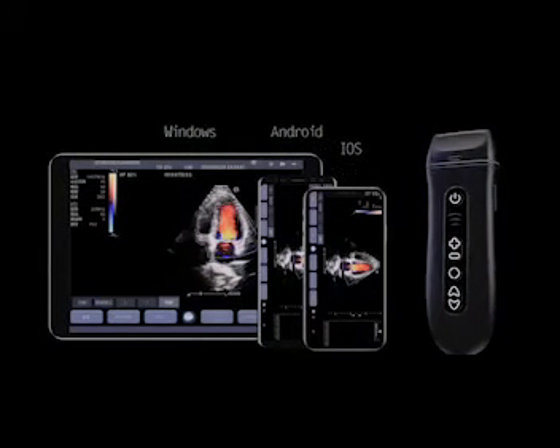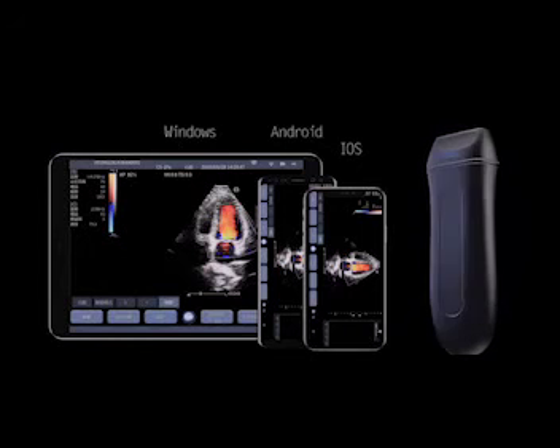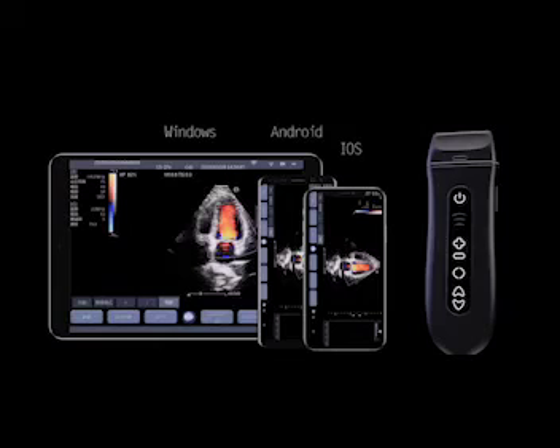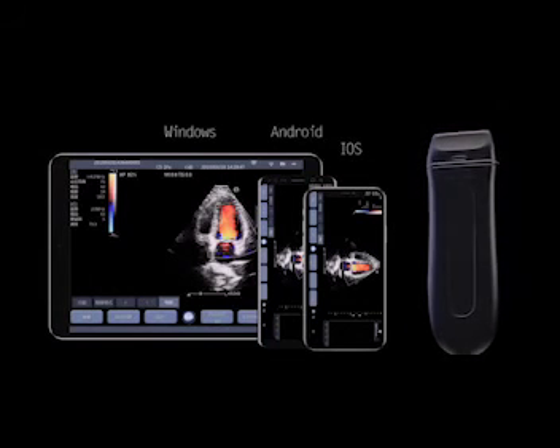Low power consumption with high productivity — capable of 5 hours of continuous scanning time. The Q7 also supports Windows, Android, and iOS operating systems on PC and smart devices.